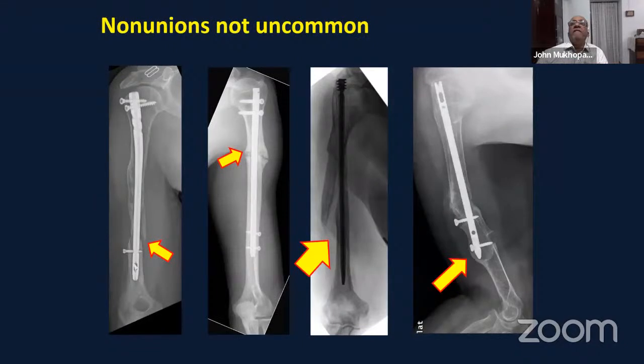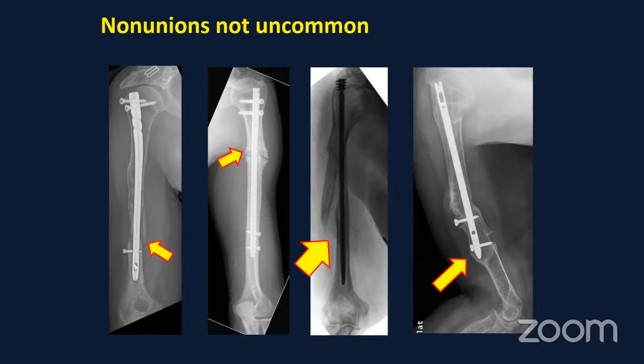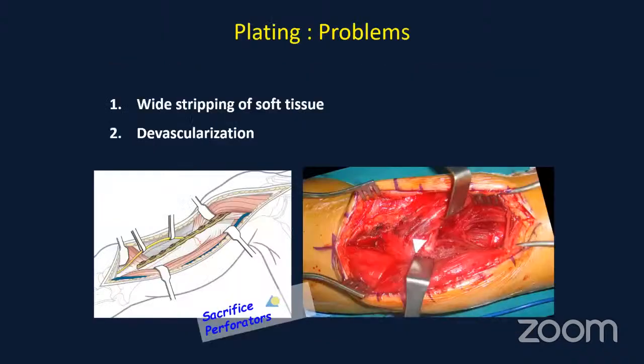Transverse fractures have a tendency for non-unions and delayed unions with the nails, especially if there's any distraction at the fracture site. Although the more modern generation of nails do have the ability to compress at the fracture site.